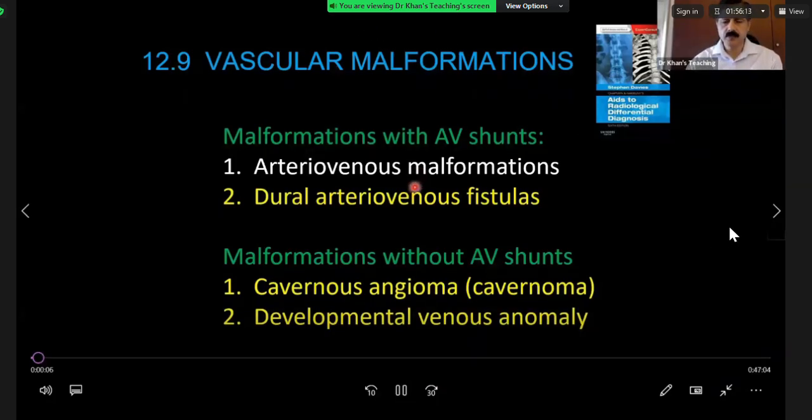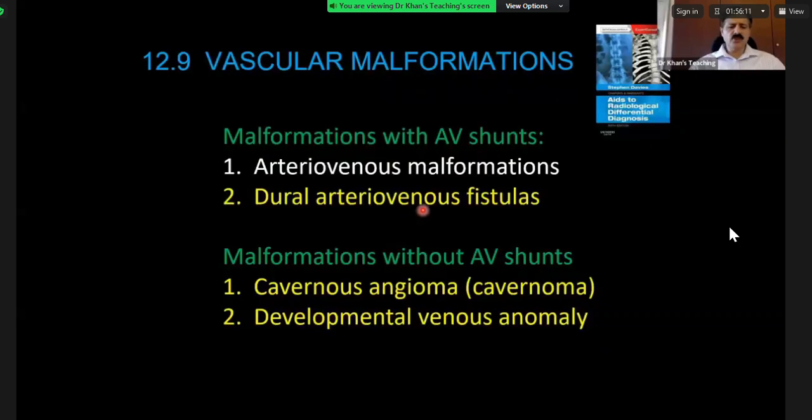Okay, so let me just recap here that the vascular malformations, this is from your last chapter, arteriovenous malformation, they will only show you in the exam if the presentation is subtle. I am going to show you a case. But otherwise it becomes a very easy film. So nobody is going to show you unless it's subtle, non-enhanced CT followed by an AVM.